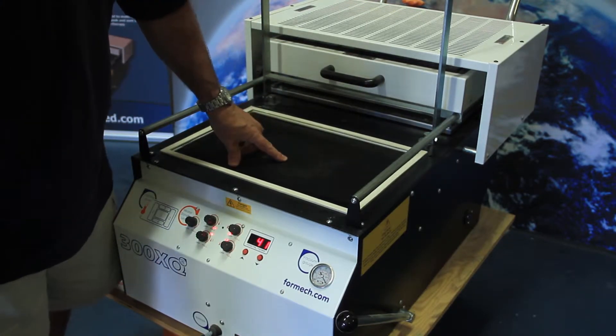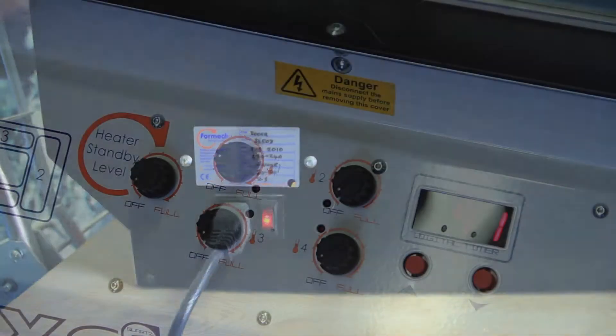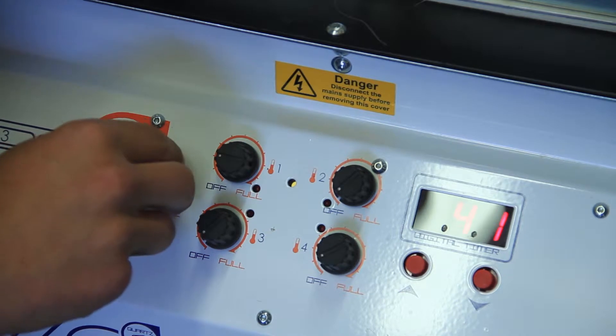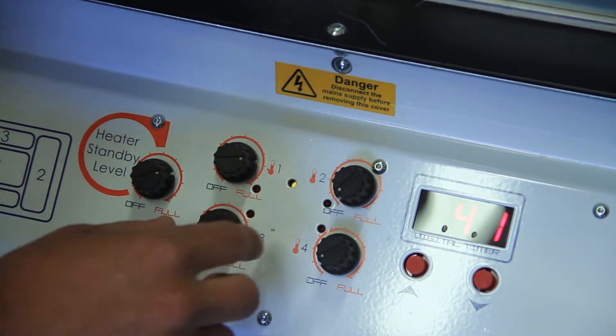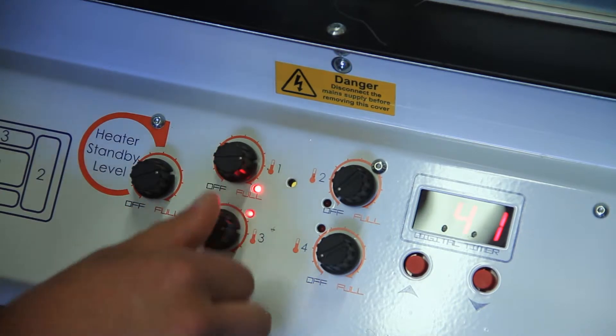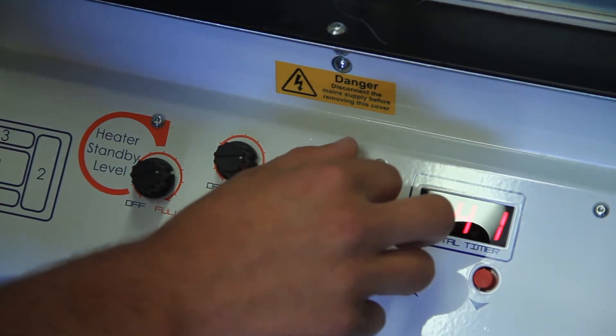Now we're going to show you how to use the vacuum forming unit. First, turn on the power switch located on the left side of the machine. Next, turn the heater standby level to full and all heat zone control knobs to approximately 80%. After this, allow the vacuum forming unit to heat up for approximately 15 minutes.